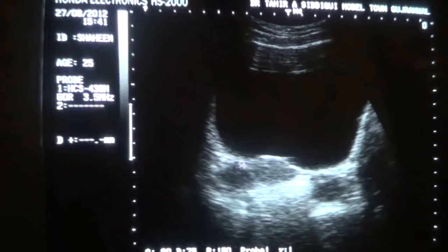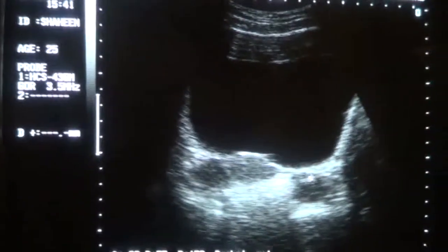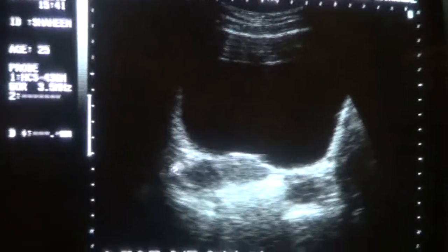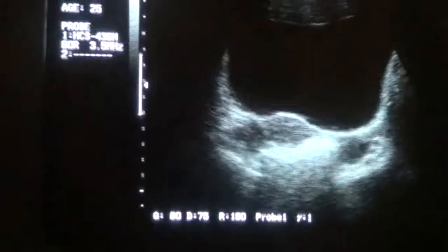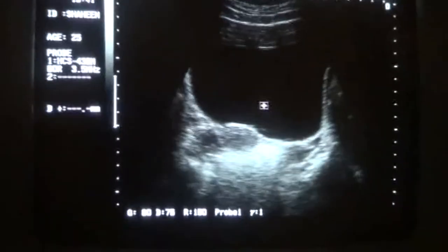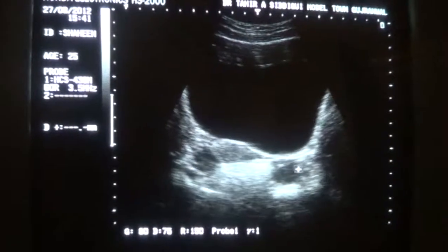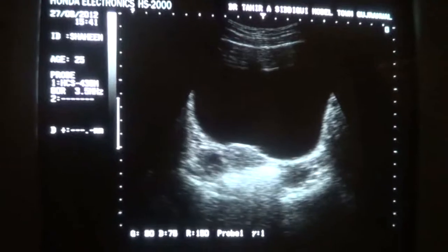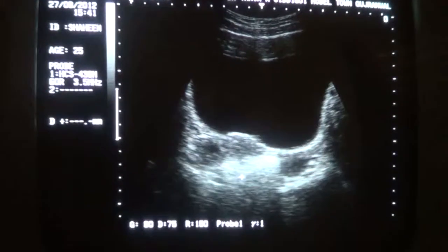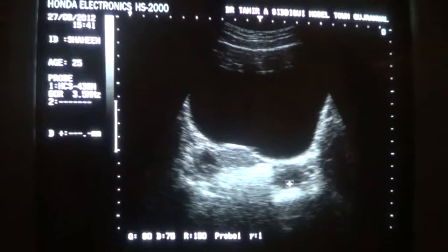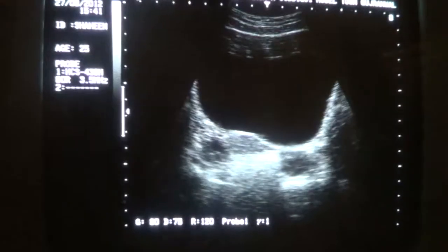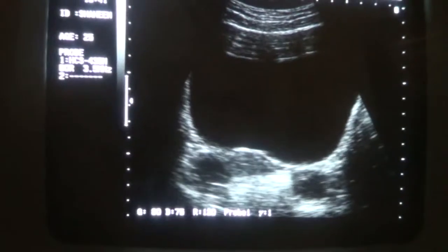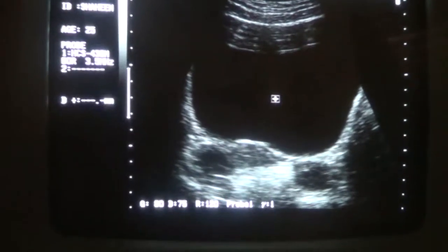This is the right ovary in transverse section, this is the left ovary in transverse section, and this is the urinary bladder. Concentrate on the ovaries — this is the left, this is the right, and you can see follicles. You can see a part of the dominant follicle in the right ovary. Sorry, in the left ovary.